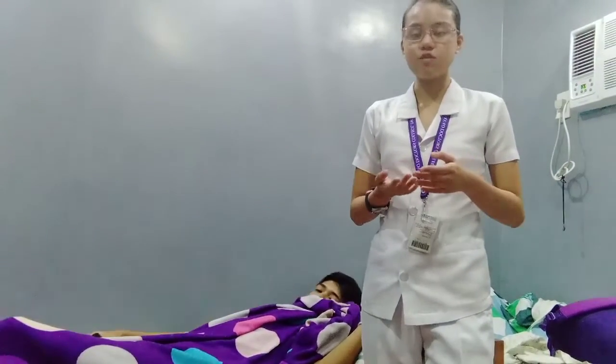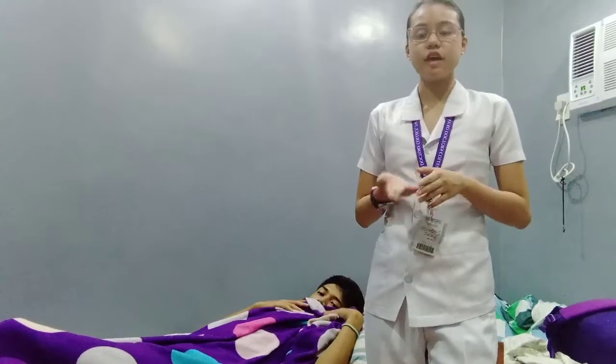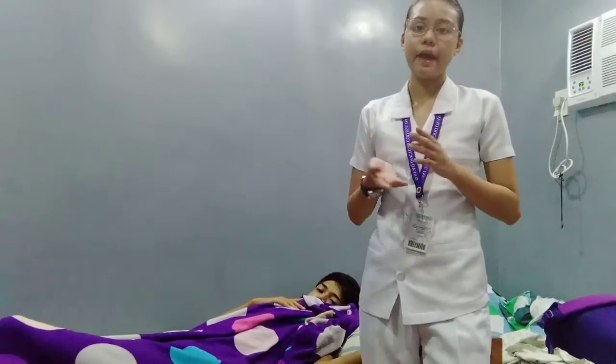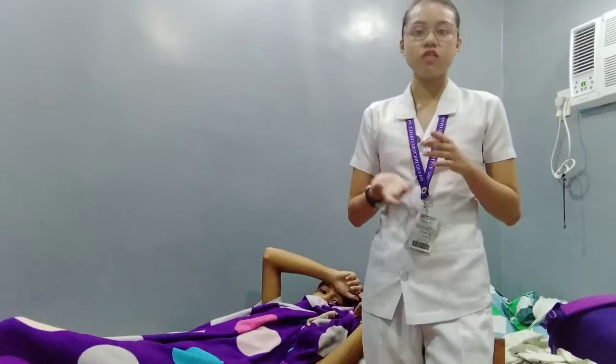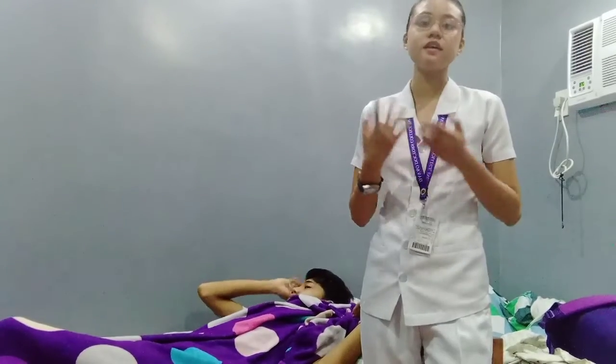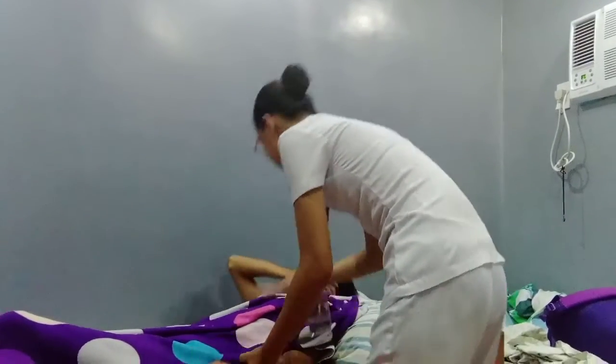Afterwards, we need to choose an injection site free of lesion and discoloration, and you select the site three to four fingers below the antecubital space and one hand above the wrist. We need to check for lesion and discoloration to find out the best injection site to avoid having internal and external problems. Okay. May I see your other arm, please?